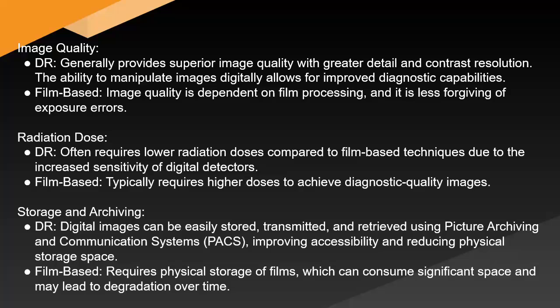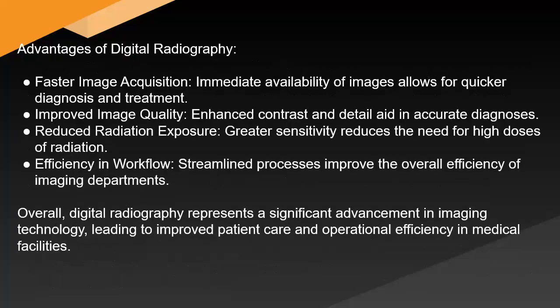Storage and archiving. DR digital images can be easily stored, transmitted, and retrieved using picture archiving and communication systems, PACS, improving accessibility and reducing physical storage space. Film-based requires physical storage of films, which can consume significant space and may lead to degradation over time. Advantages of digital radiography: faster image acquisition, immediate availability of images allows for quicker diagnosis and treatment.